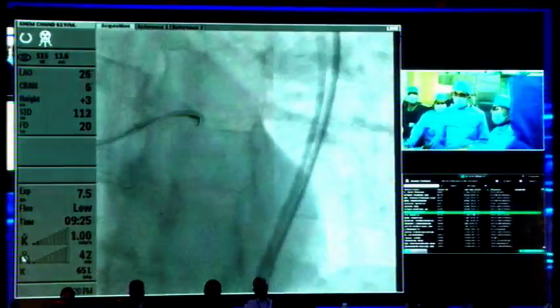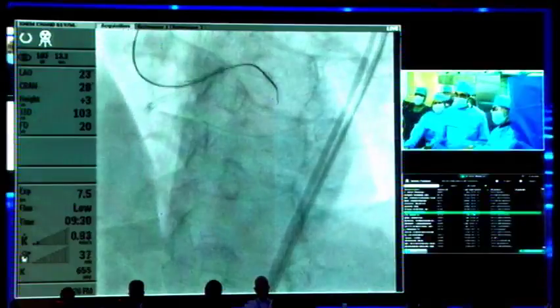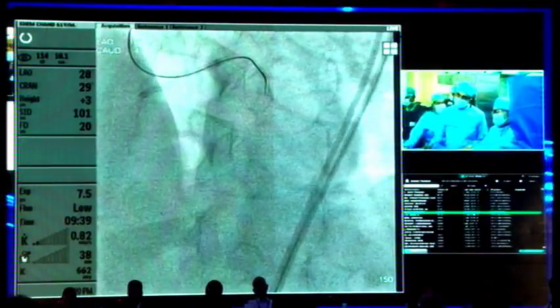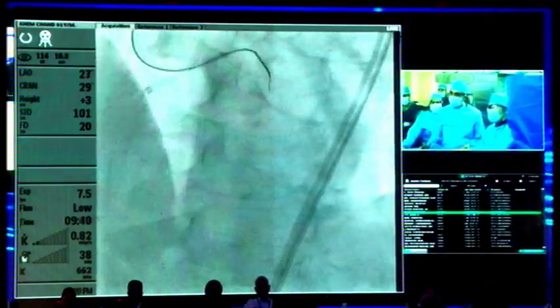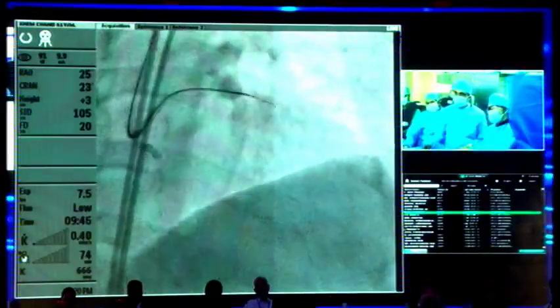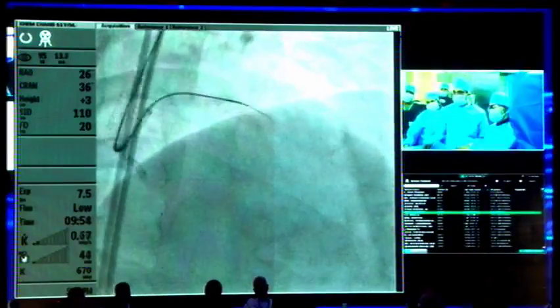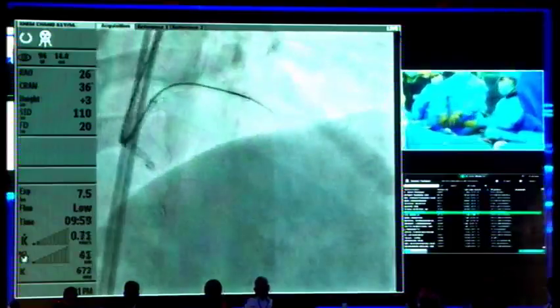So the initial diagnostic angio shows some distal bifurcation of the LAD, septal and LAD. That means the septal is a little bit more on the inner side and the LAD is a little bit straighter down. So go to the LAO cranial back. So the tip should be in this direction, and if we can correctly understand the previous angio, probably this is the direction. It seems they've already reasonably controlled. Yes, I am going to check right.